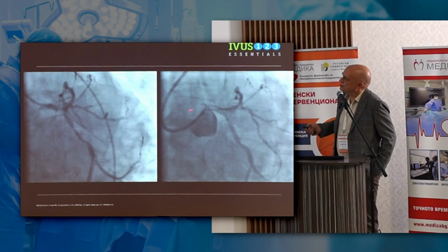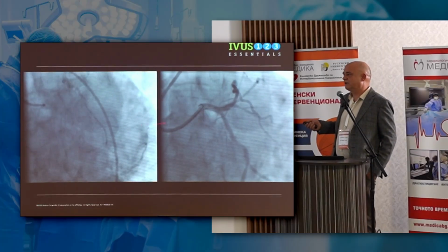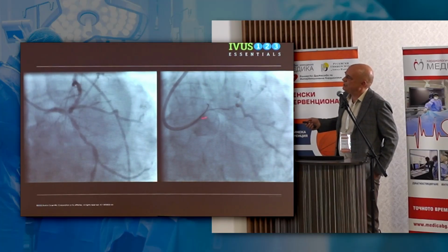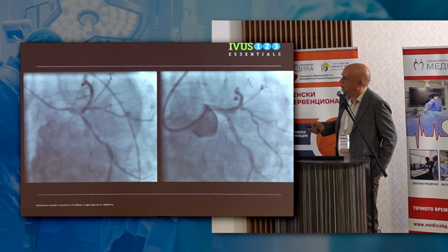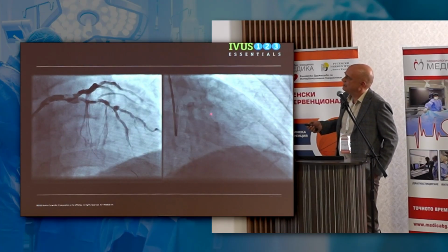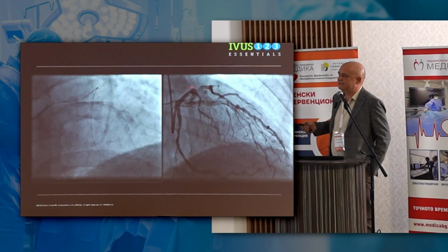This is an additional patient, heavily calcified left main, dominant circumflex. So my question is how the interventional cardiologist in that heart team for the study chose and gave a green light to have this patient in the study, because this is a high-risk complex PCI. Also here we have heavily calcified plaque in the left main, and there is, I think, probably good apposition but bad stent expansion.